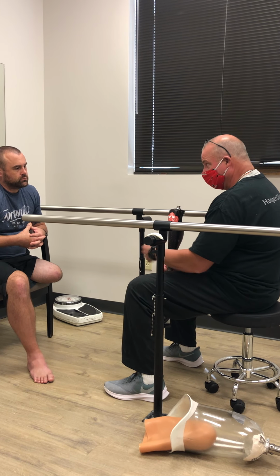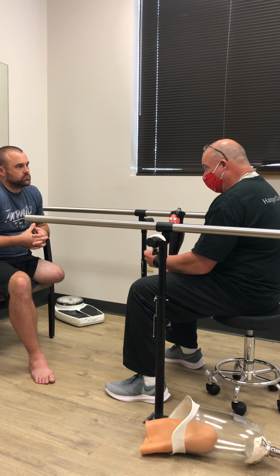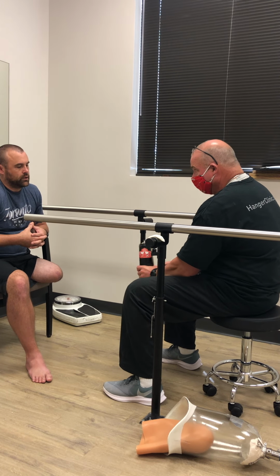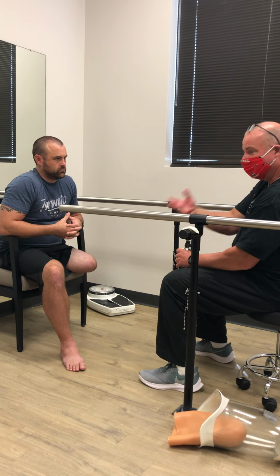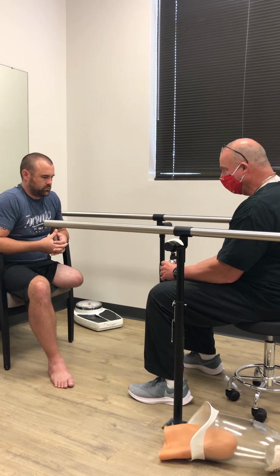You're nice and strong, and I'm not taking anything away from you, and I think your suspension should be great. That will help. However, you're still dragging around this. So I always tell people, that's another reason I like running shoes: they're made for people running long distance, so they're made super light. Some of them are 8 ounces. They don't weigh anything.